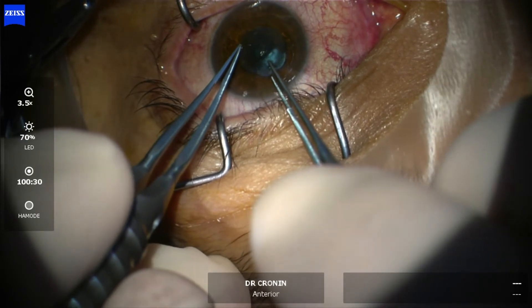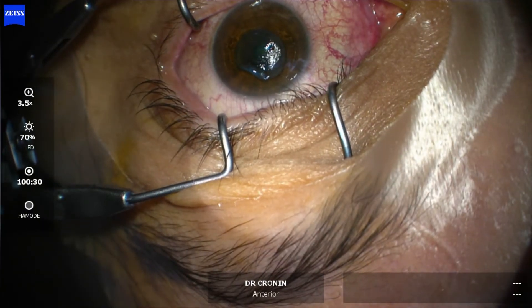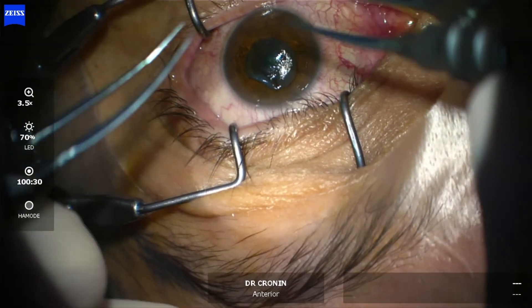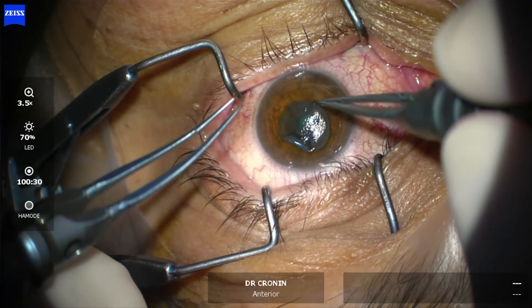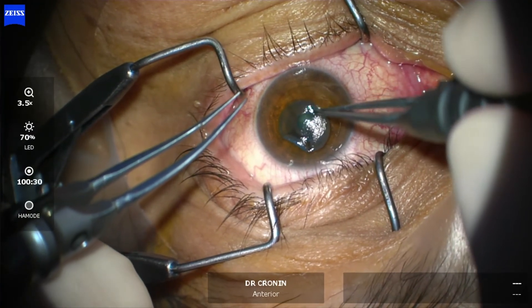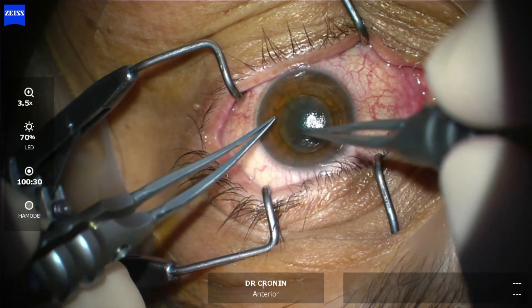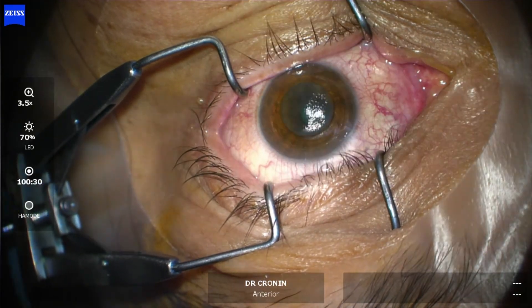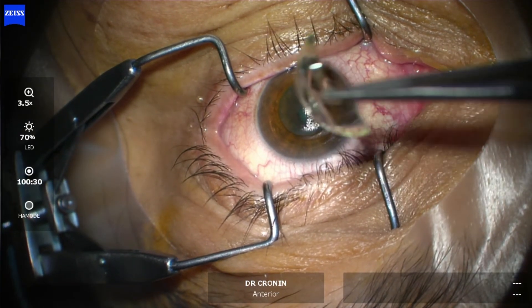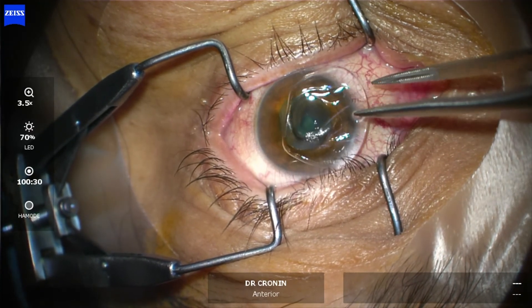You don't need to know anything about what's happening to your eye. The Bowman's membrane is placed on top of the eye. Very occasionally a stitch or suture will be used to hold it in place, but most of the time a bandage contact lens is just placed on top of the eye, and that Bowman's membrane integrates into your cornea and adds that extra bit of rigidity and structure that your eye needs to maintain a better shape — to facilitate either better vision from the procedure itself or further procedures to facilitate better vision. You can see here a contact lens is placed over the eye.